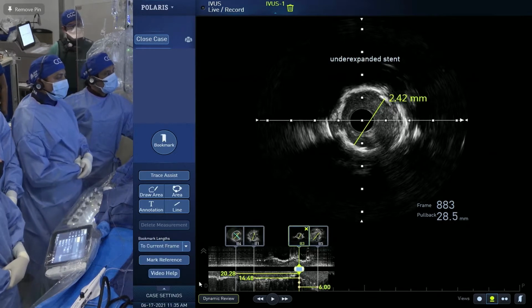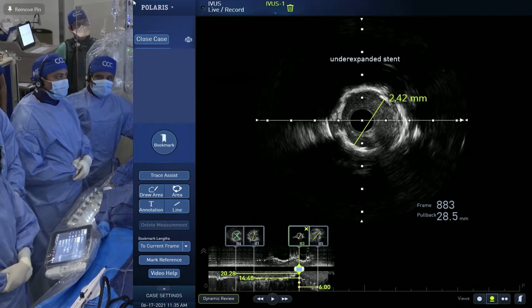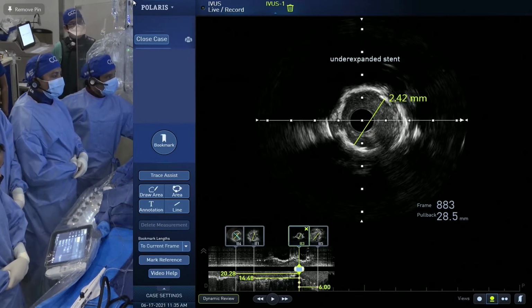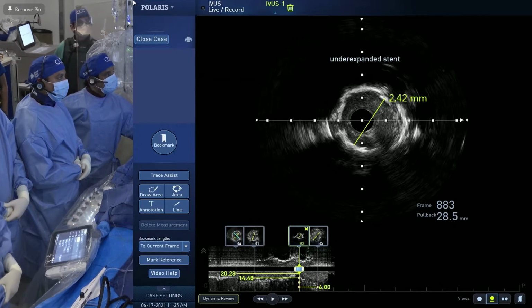Dr. Nicholson, what's your approach here? What would be your approach? Yeah, thanks. I think you really have 2 choices in these scenarios. I think coring it out with a larger and larger rotaburr would be one option, and then this is one of the places I think laser is very helpful, with a 1.4 laser with max fluence, max frequency.